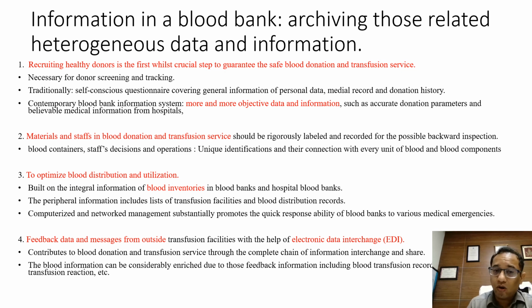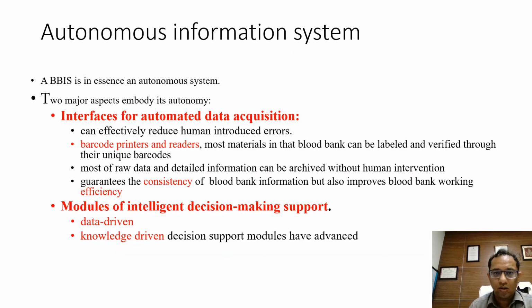Now, feedback data from outside is another aspect of information which needs to be there, and this involves electronic data interchange. And this contributes to the blood donation and transfusion service through the complete chain of information interchange. And the blood information can be considerably rich if we have the feedback from the external sources.